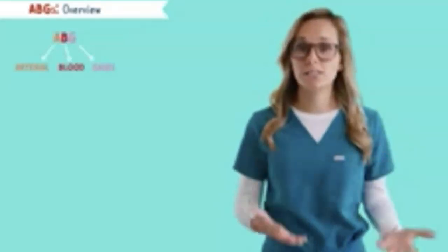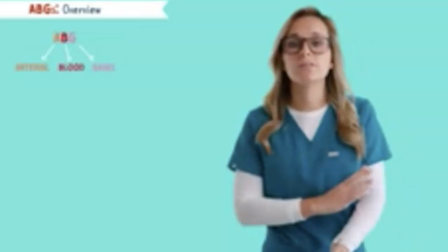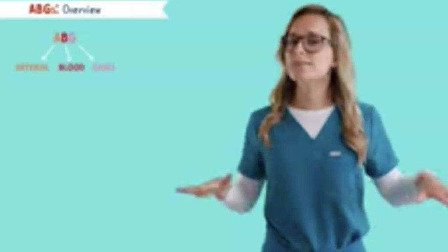What are ABGs? ABGs stand for arterial blood gases. It's just what the name says. It's a measure of the amount of different gases and pH in your arterial blood. ABG testing is most commonly seen in the ICU. It needs to be taken from an arterial line, or it can be taken through a puncture. It's not the same thing as a venous puncture.